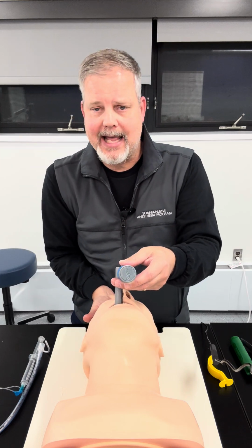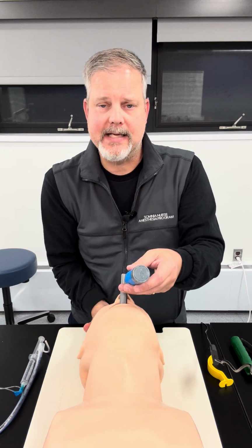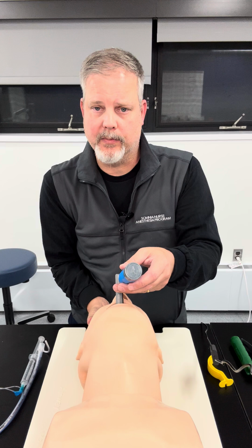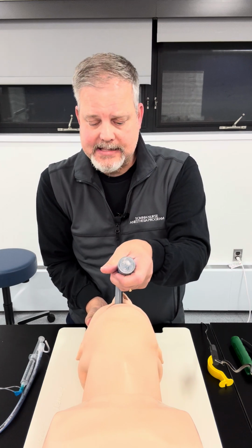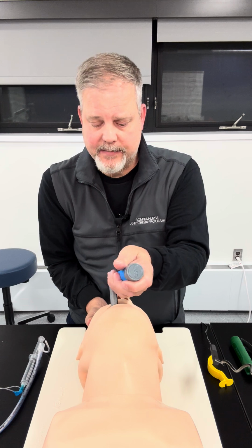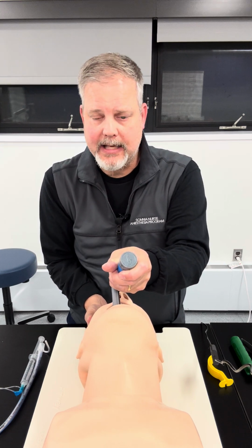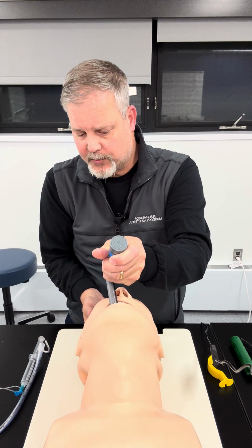And then I'm going to put my hand right here behind the occiput, and I'm going to put them in that sniffing position by taking the occiput of the head and pushing it forward a little bit. So now I've got basically their nose pointing towards me. As I slide in, I am going to get into my position and lift up and out. I am not going to rock my hand back, but I'm going to lift up and out and look to see if I see the vocal cords.